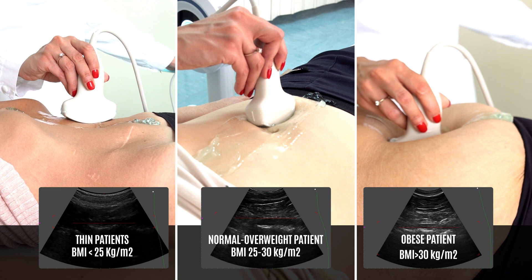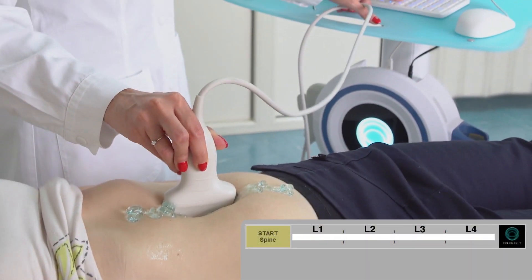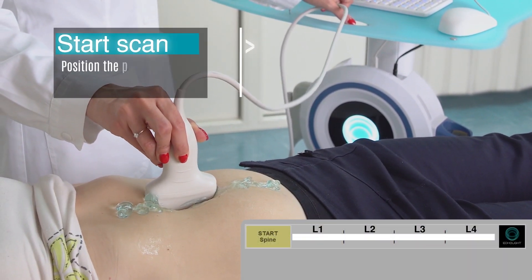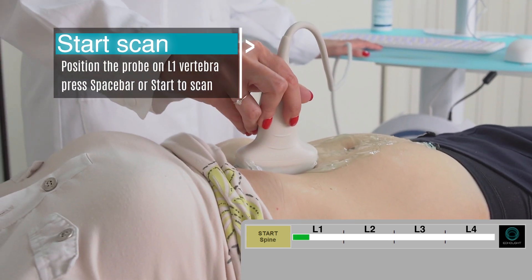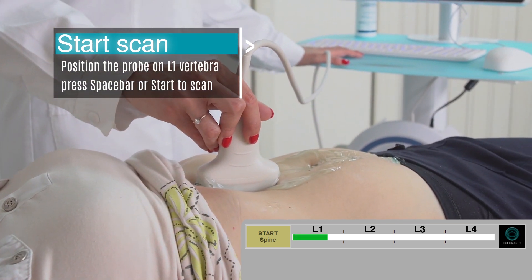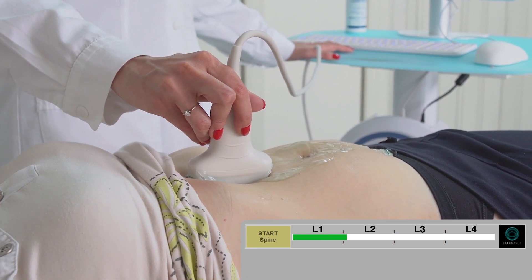After the pre-scan and after identifying the correct depth and focus, position the probe on the first lumbar vertebra and start the scan by pressing the space bar on the keyboard or the start button on the ECOS Studio interface. The green bar displays the scan progress.